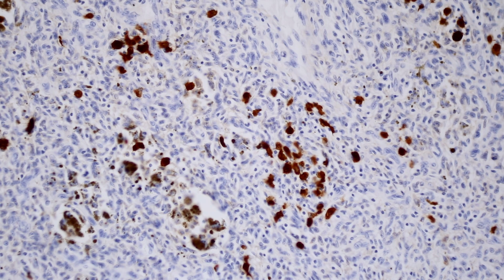And in fact, if you do an S100 stain on something in the skin and there's no staining anywhere, no scattered cells in the middle of a tumor or in the dermis, you should stop and check your controls, particularly your internal control, and make sure that stain actually worked. Because definitely these are very common, and you should see scattered dendritic cells on an S100 stain. If you don't, you should make sure the stain actually worked. And I've had a few times where that saved me, and I realized the stain was not working appropriately because I didn't see enough dendritic cells in the background. So that's one thing to point out.